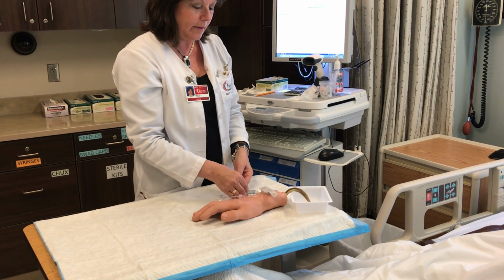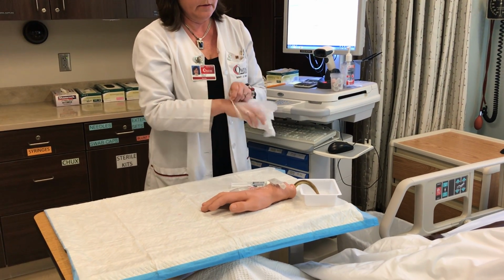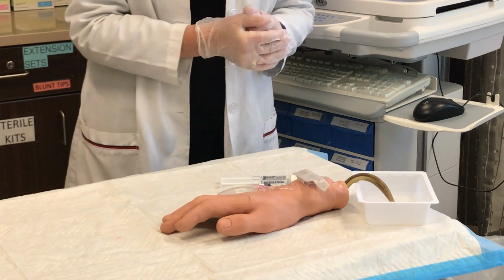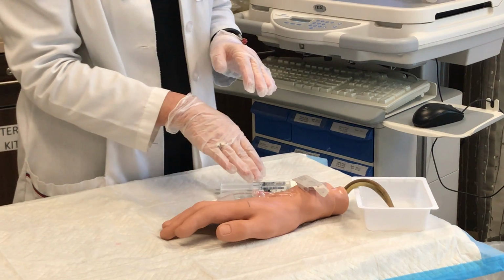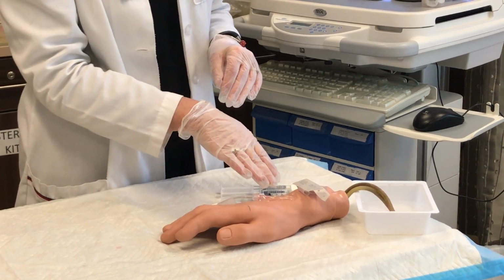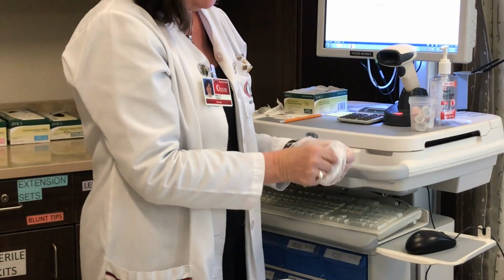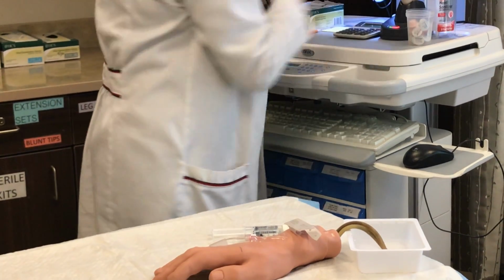Okay, thank you. Apply clean gloves. Assess IV site for any signs of phlebitis or infiltration. Remove gloves. Perform hand hygiene. I'm looking at the site for any redness, warmth, or tenderness that would indicate phlebitis. If something was infusing previously, I might have signs of infiltration, which would be swelling or coolness or any discomfort. Remove my gloves, glove to glove, skin to skin, and wash my hands.